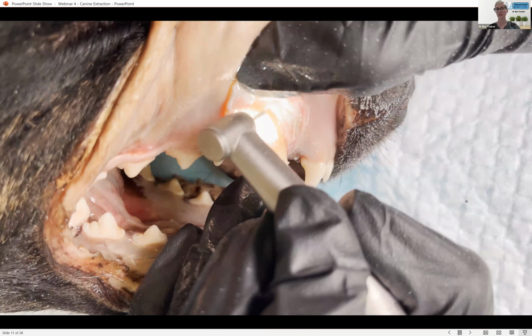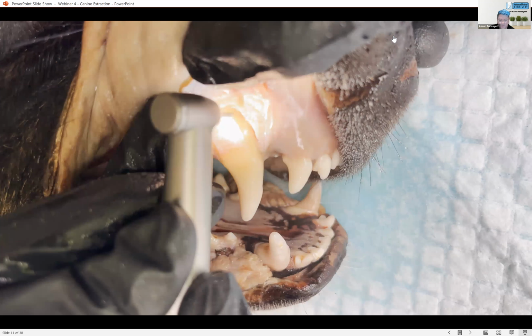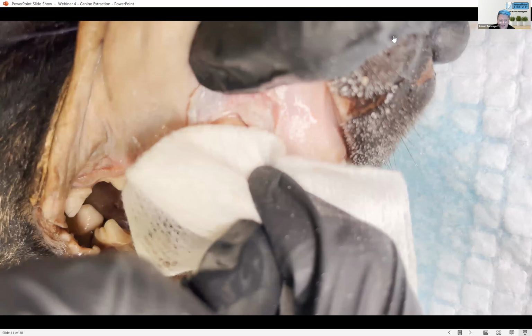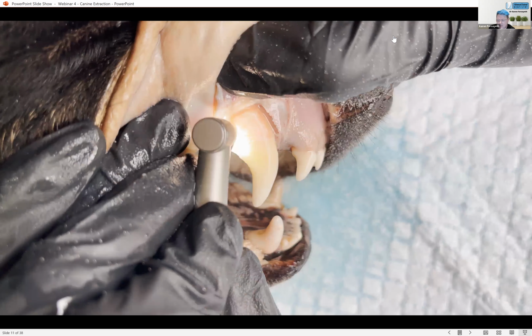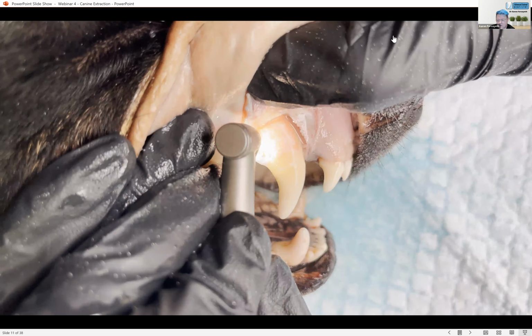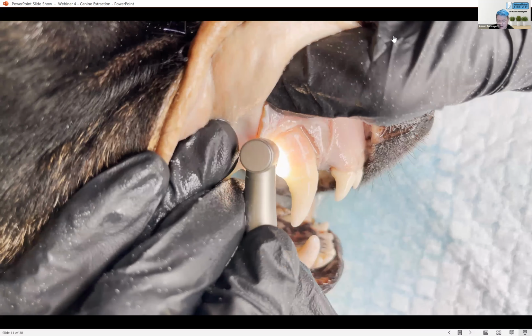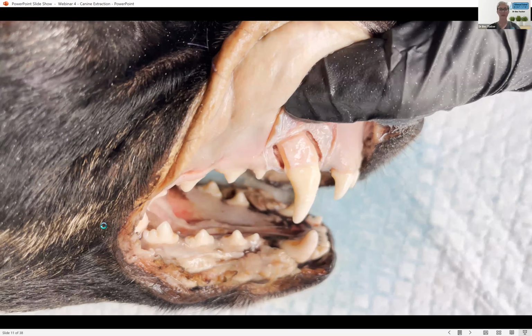Yep. So those 2 incisions have been made. I think Beck's going to go back and make them a little deeper. But they've just been joined with that shallow cut just through the bone. Yeah. I'm trying not to damage too much of the tooth root itself. But here we're going. And again, if it's stuttery for me, it's probably stuttery for you guys. Where I'm seeing this deeper cut, deeper channel. We were discussing, what do you call these things? We call them moats. That's our best description. So there are these incisions mesially and distally to the tooth root. We're not cutting through the tooth itself, although if you're going to err on the side of cutting through some tissue, you can cut through a very small portion of the tooth root. And they've been created and made a bit deeper.